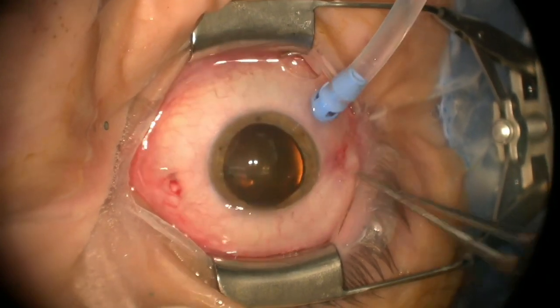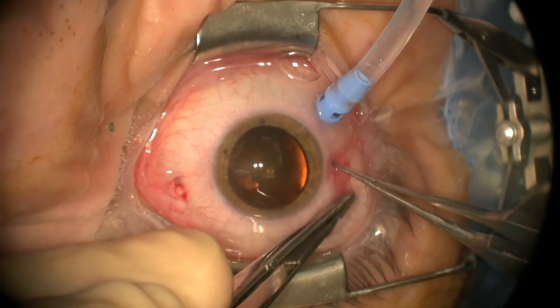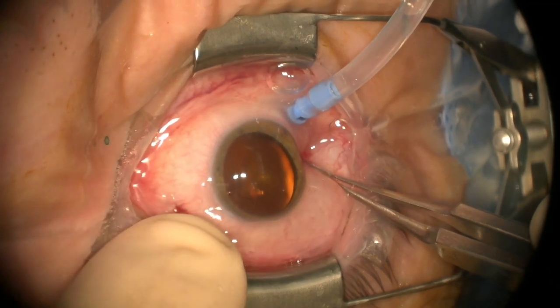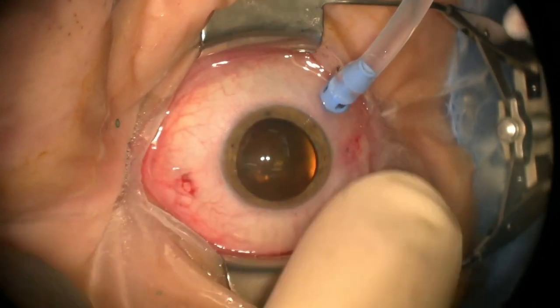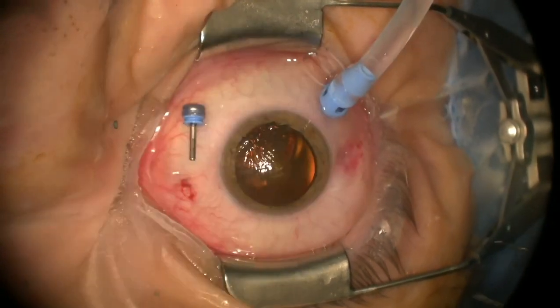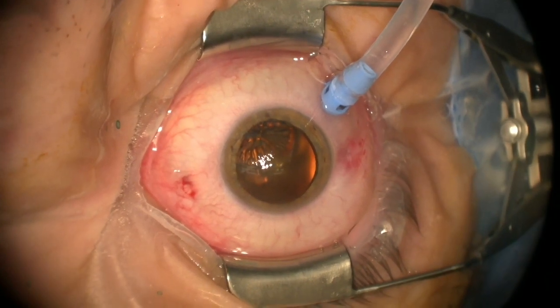I'm always learning from, frankly, very good surgeons, bringing me new ideas that make a lot of sense. I love this collapsing the tunnel technique in particular. Jenny's going to dry that for us and again show us that there's no leak. Now we're going to pull this last one.